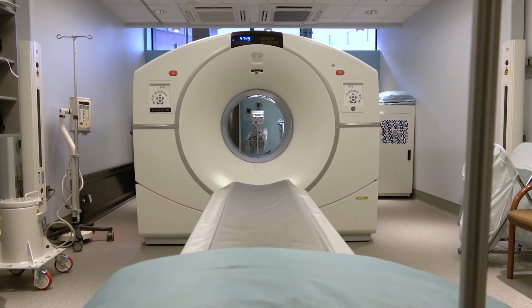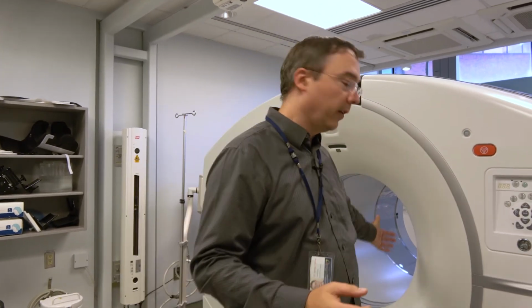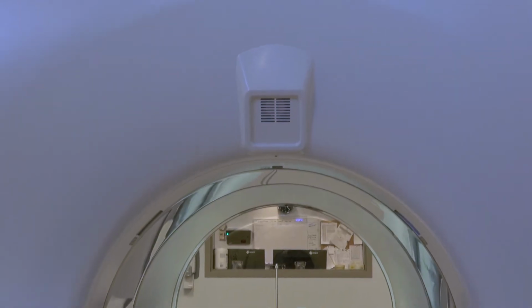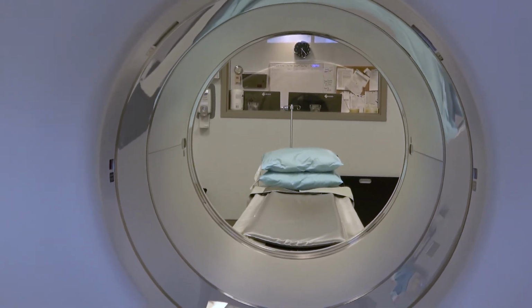So remember that there's 2 parts to a PET CT scanner. There's the PET part and there's the CT part. The CT is here at the front, so they would have the CT scan, and then the PET part is at the back. You might be able to see that sort of glassy looking thing in the back there. That's where the PET detectors are.